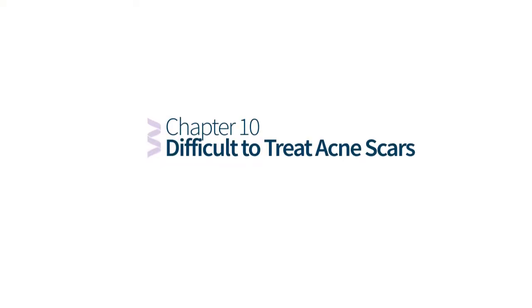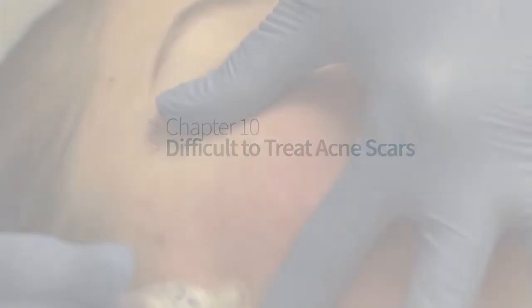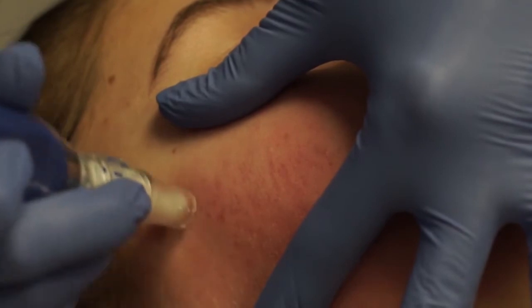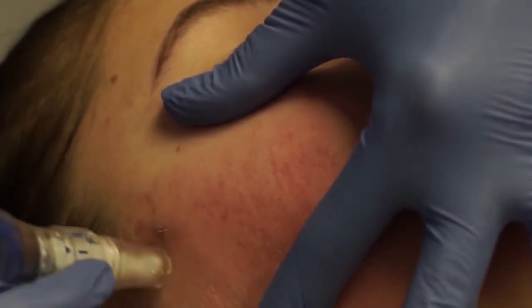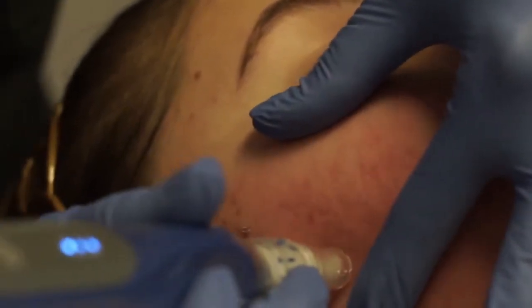Difficult to treat acne scars. Again, you will move from section to section on the left cheek using your horizontal, then vertical, then circular passes with more focus on the areas with deeper acne scars.